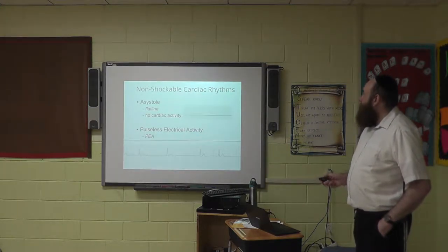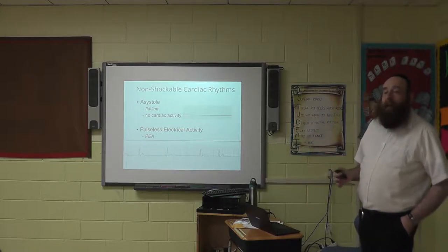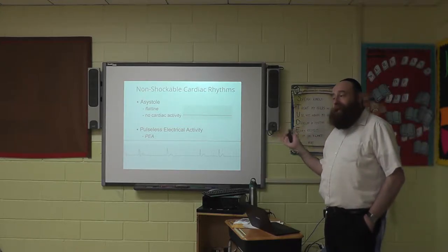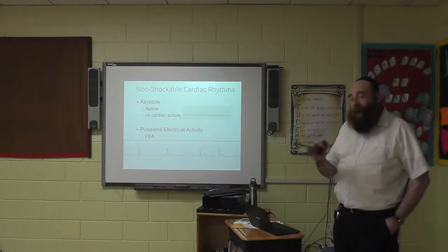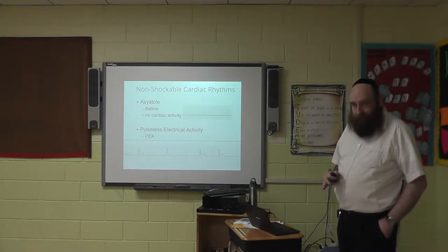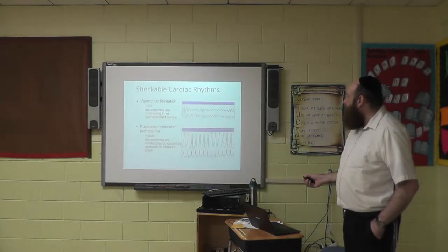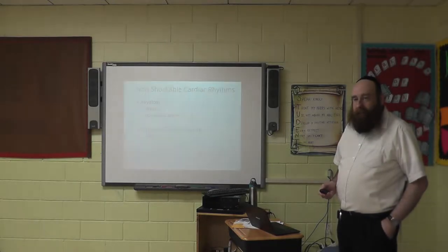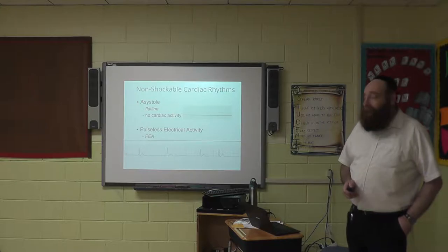All right, asystole, this is the flat line, famous dead. This you cannot shock. You cannot defibrillate dead. I know they do in all the movies. It is wrong. It's Hollywood. It's not true. It's just useless. You need electrical activity. Flatline means it's too late. You can't shock a flatline. Flatline, you do CPR. Get medics.